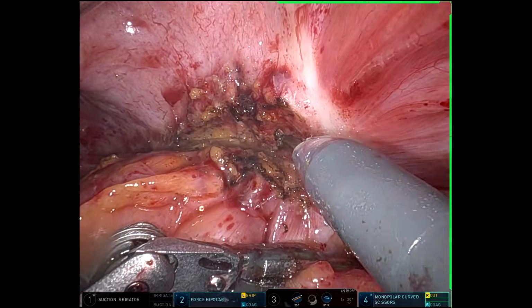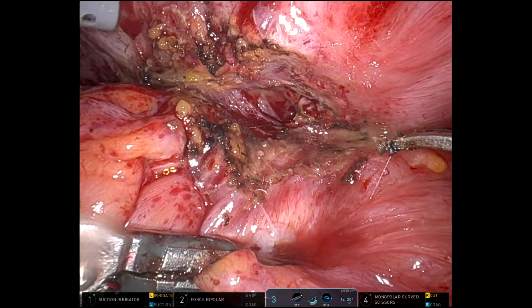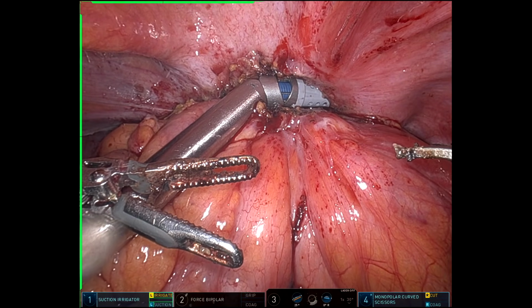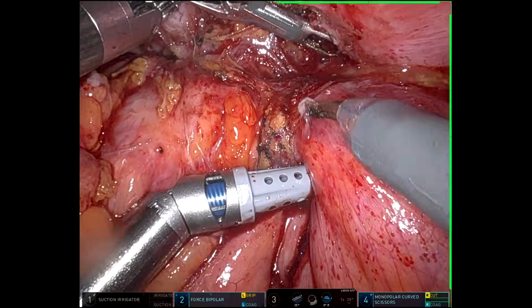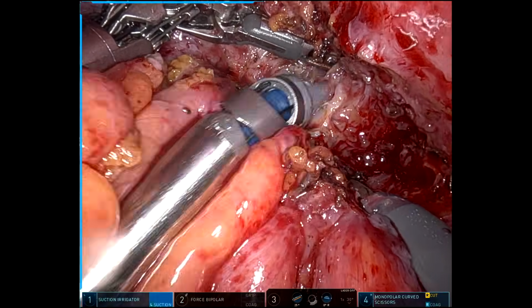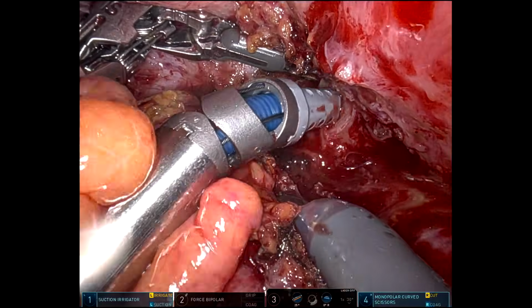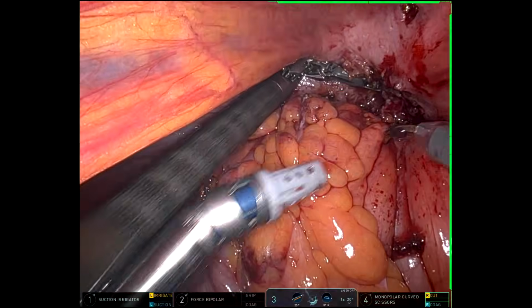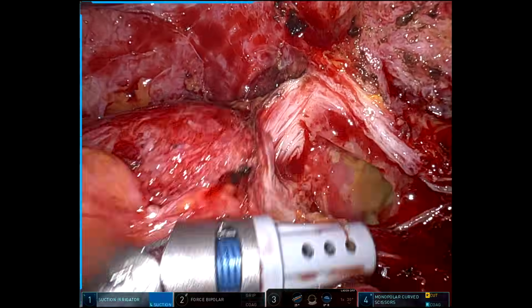The patient still has a uterus, so I know I'm going to come up to that in a second. That's the intramural abscess in the wall of the bladder. And I'm trying to get this down off of the bladder and behind it the uterus. Go work in another area.